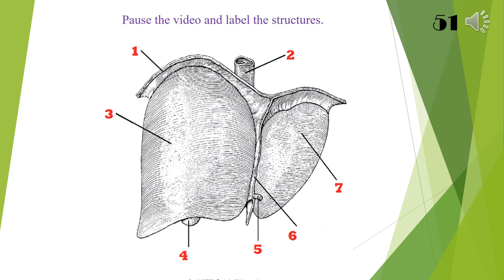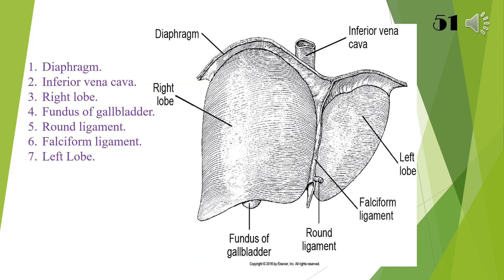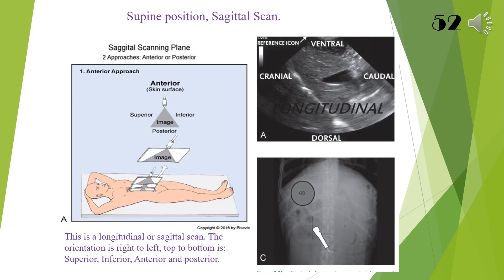Pause the video and label the structures: 1 diaphragm, 2 inferior vena cava, 3 right lobe, 4 fundus of gallbladder, 5 round ligament, 6 falciform ligament, 7 left lobe.